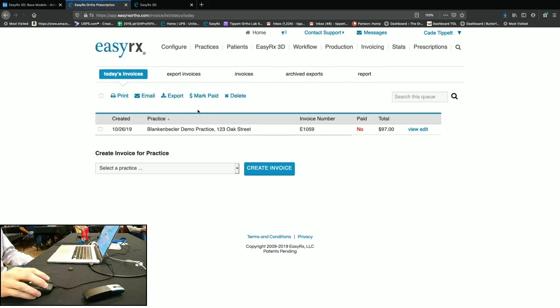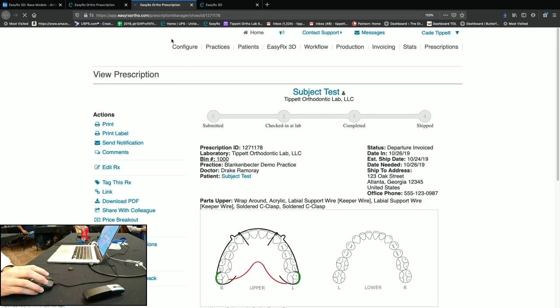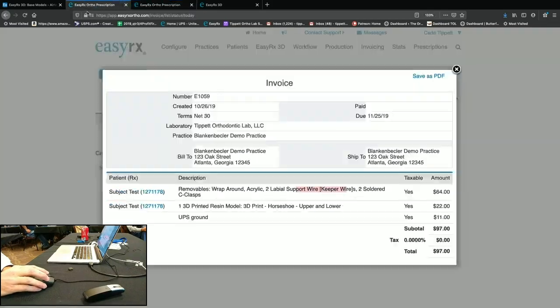Then I can go to invoice here, and now, if you can view it, there's the cost. There's the wraparound, the keepers, it's all listed there. If I need to make a change, I can go back by clicking here and go back to the script.